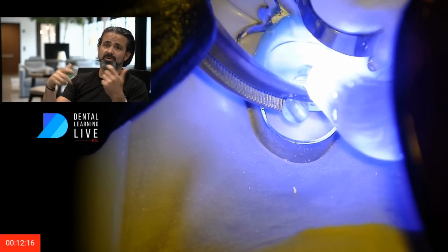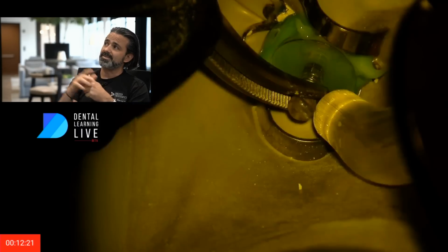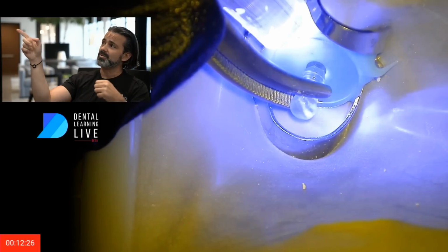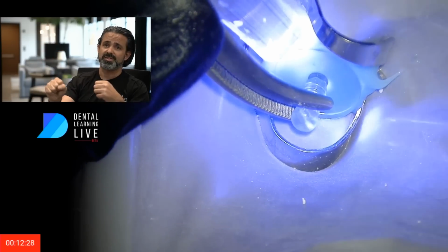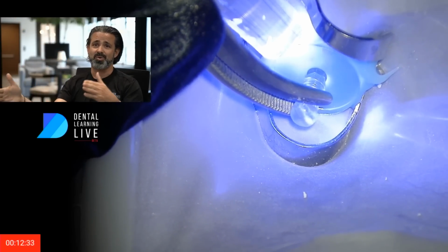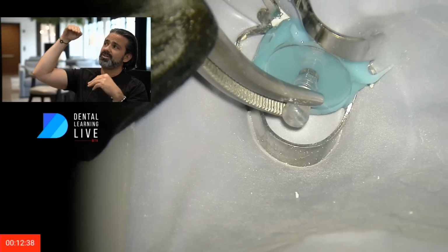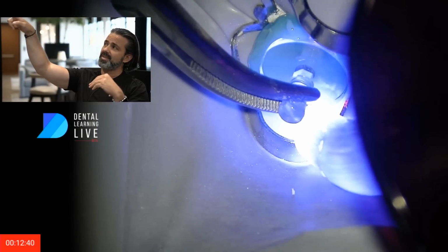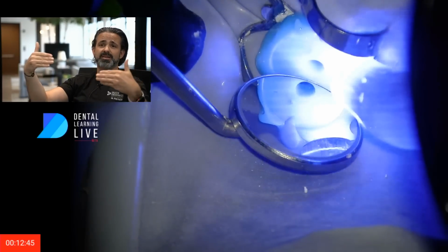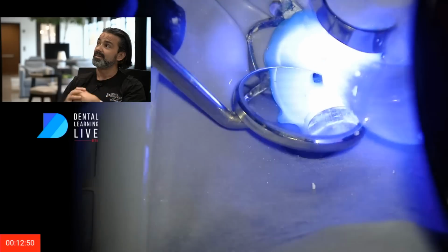And so, it serves you to be ambidextrous or just have a really good assistant, and sometimes they can even hold that platform and then you can have both hands if you need to use a mirror. But when you do it this way, you can get it all done in one setting. And if you see how I'm curing it, I'm curing it on the lingual wall first and then the buccal wall, and there's strategy behind that. Because if I cure from the top down, like if I rest it right on that matrix, I've got a tall depth to cure. But if I come in perpendicular, I'm only a few millimeters deep right there. So I can get a really good set in that fashion.